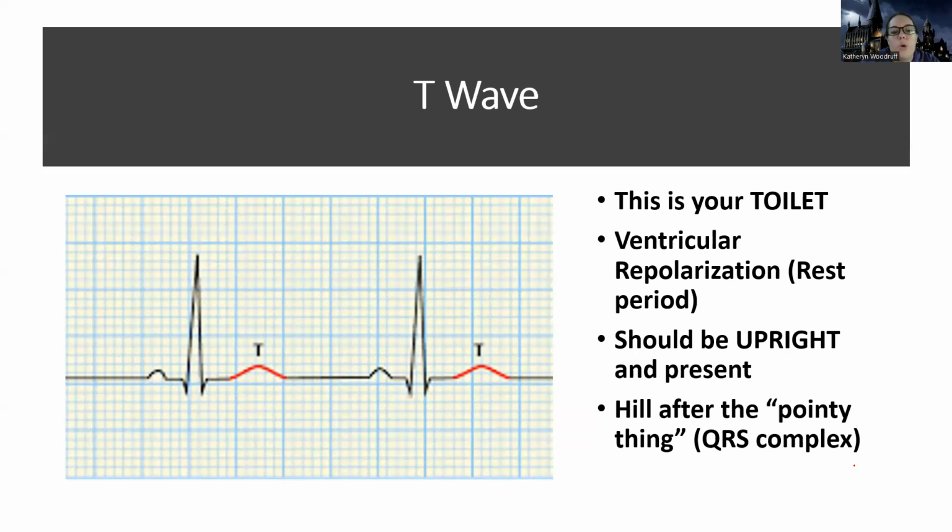And other times you would see it not upright is we can sometimes, I'm looking for my thing here. Okay, there it is. Sometimes what can happen is we can have T wave inversion where it actually goes upside down. I'm not going to draw on this for this one, but anyway, sometimes it can be upside down.